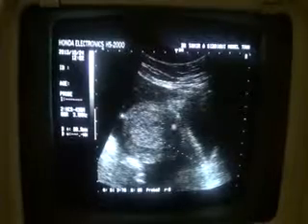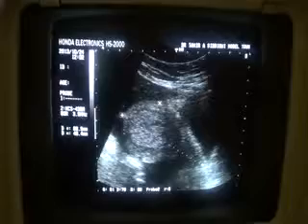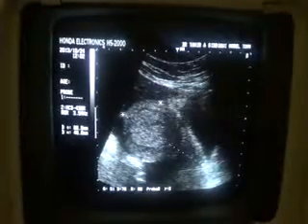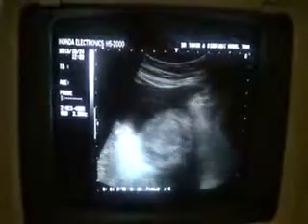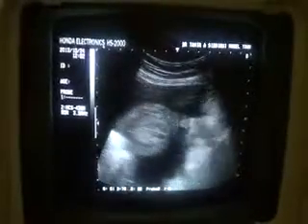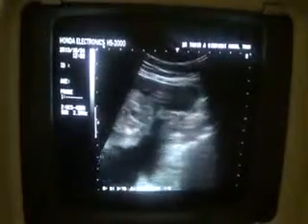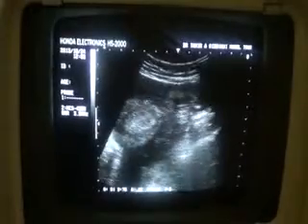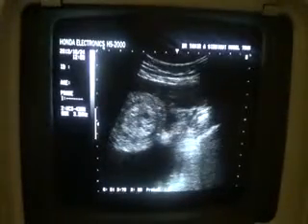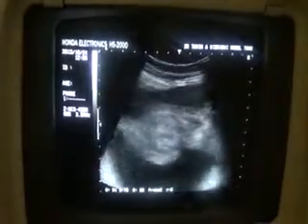However, the size of the uterus is 8.8 centimeter in length and 4.8 centimeter in anterior-posterior diameter. So the uterus is definitely enlarged given the age of the patient, being postmenopausal. This is the round ligament.